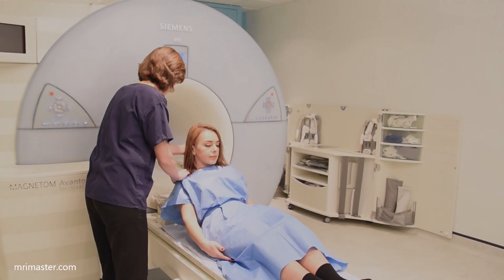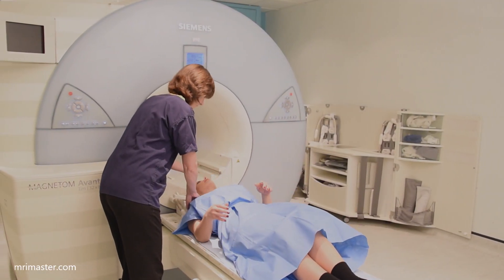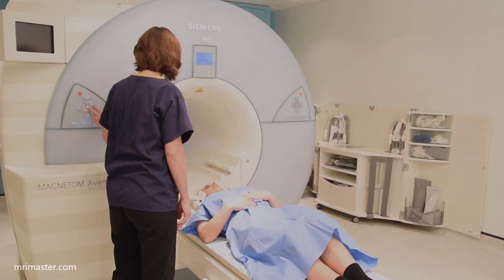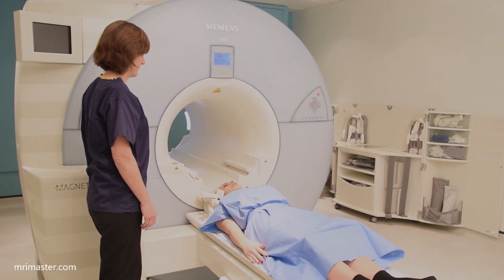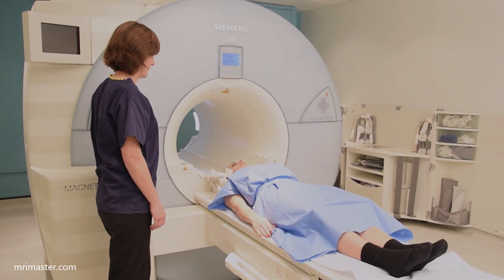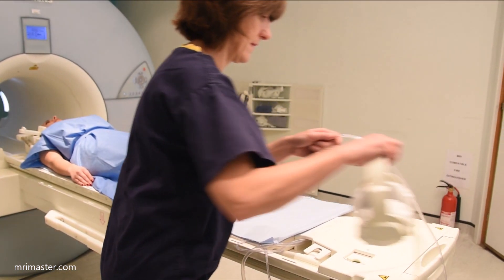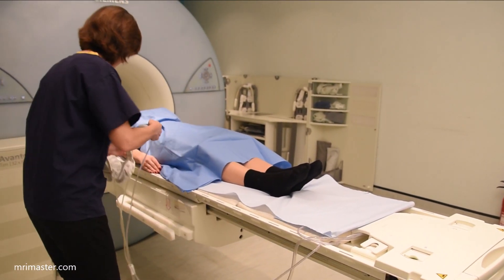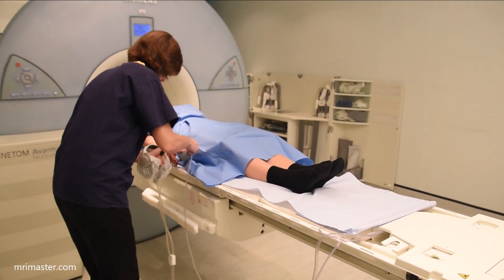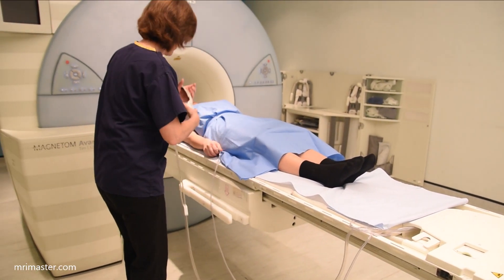Once the patient has been screened and is deemed safe to have an MRI scan, ask them to lie supine on the scanner table with their head in the head coil. Give the patient an emergency alarm, making sure they know how and when to use it.